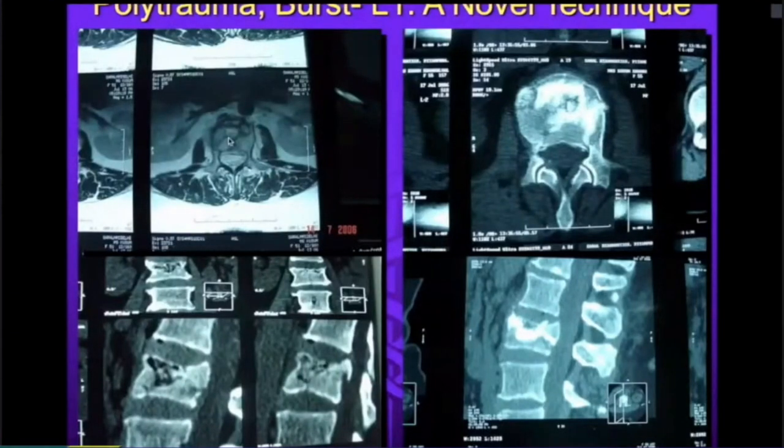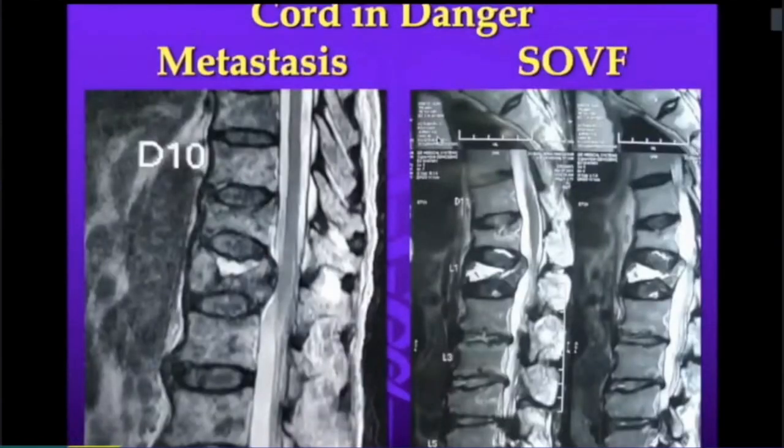This talk was at a spine surgeons' national conference. And this is the cementing, and this is nicely well cemented. You see the even retropulsed fragment is taken care of. And there are a few patients where the cord is getting compressed. The patient has widespread metastases, life expectancy is low, unfit for major surgeries for that matter.